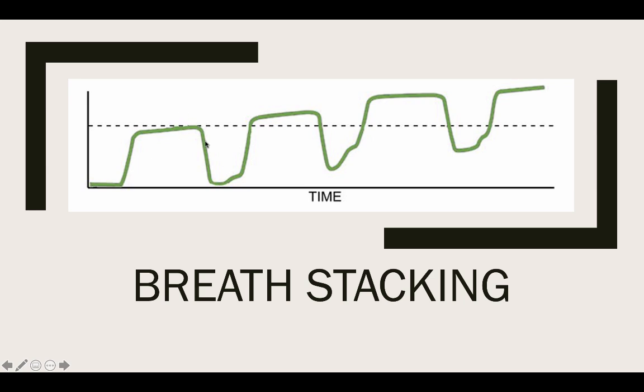So we've got a normal looking wave, right? So kind of squarish looking, kind of squarish looking, kind of squarish looking. But every CO2 level, end tidal, right here, is going a little higher, a little higher, a little higher, and our baseline keeps going up and up and up. And what we're not doing is allowing for full expiration. So in essence, we are trapping air in our patient's lungs for them.